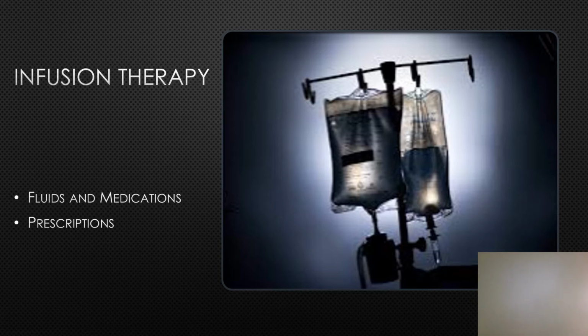For intermittent infusions, we need the route, the solution and medication, the amount and dosage, and the frequency. Be aware of the fluid types and the expected outcomes, and always verify the compatibility of fluids and/or medications if they're administered in the same site. Incompatibilities can cause precipitates in the fluid or change in the action of the medications. Infusions can be administered continuously or intermittently.